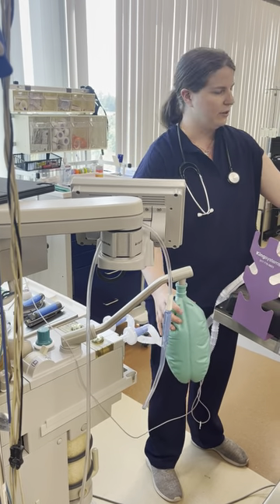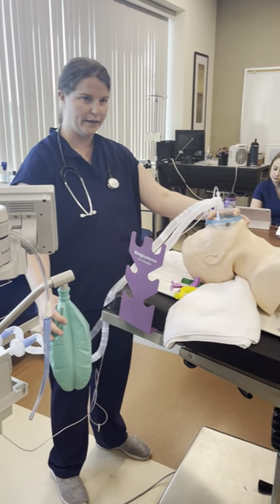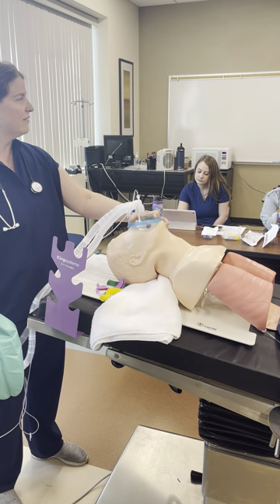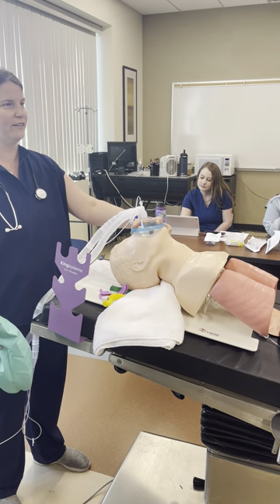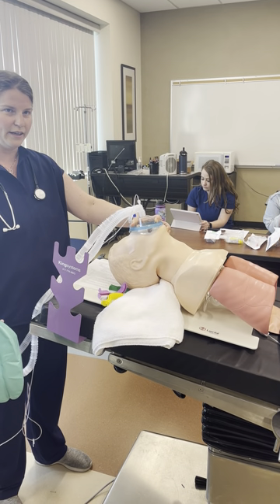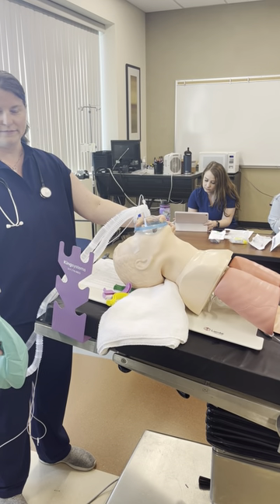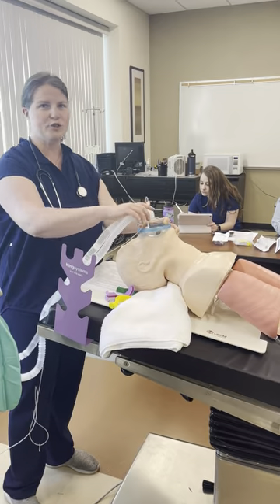With the APL closed, it's just squeezing the top of the bag. If you can mask ventilate, all is well. Nothing else matters — even if you have a difficult time intubating, as long as you can ventilate, everything is fine.